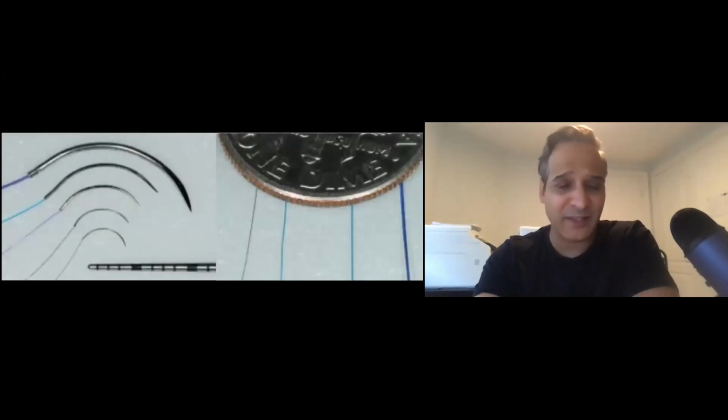And this is just another type of microblade. This comes from microsurgery. It's actually a small piece of a razor blade that you break off, and then you use this blade clamp. It's like a blade holder that clamps down on the piece of the blade, and then you tighten it and it holds it in place, and it can be used to make small micro incisions.